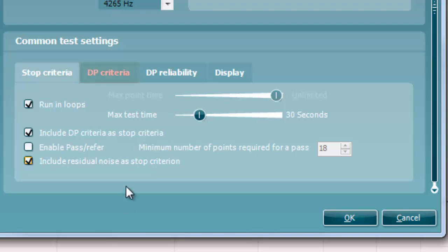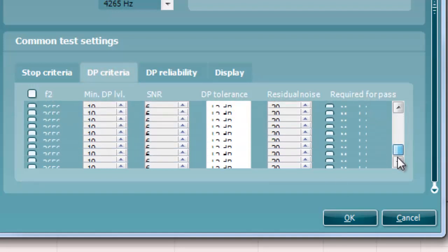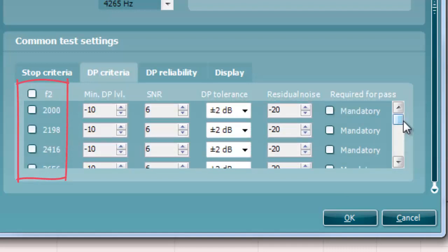Next, we move to the DP criteria tab. Under this tab, both pass and stop criteria are defined for each individual added frequency point. A table exists with five columns. The first column displays the frequency at which the criteria is set to.